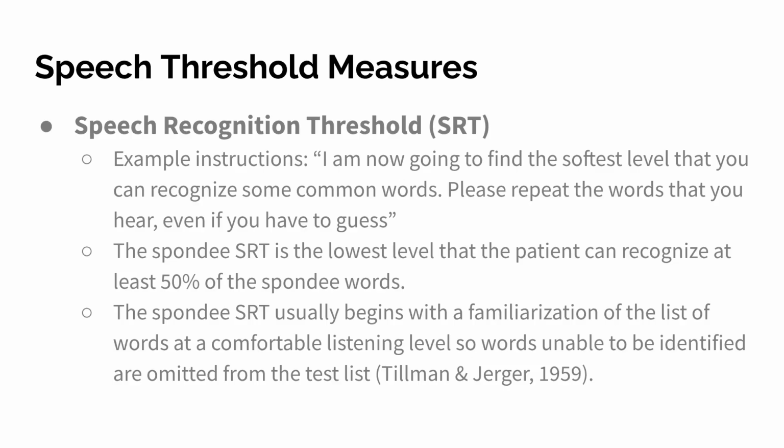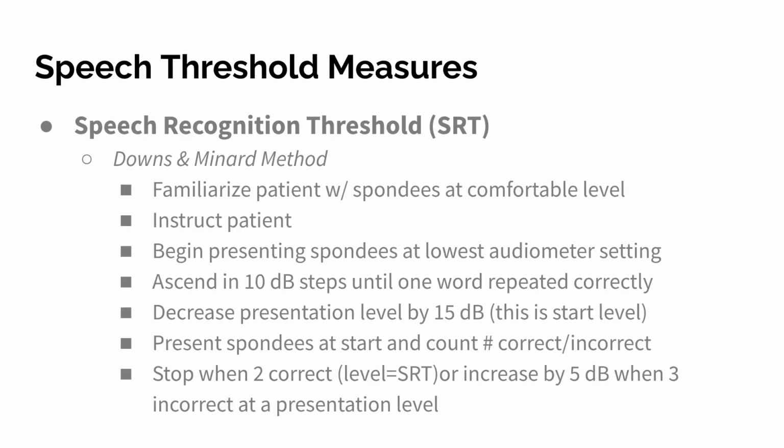These are fine too. Spondee SRT, or spondee speech recognition threshold, is the lowest level that the patient can recognize at least half of the time. Spondee SRT usually begins with a familiarization of the list of the words at a comfortable listening level, so words unable to be identified are omitted from the test list. I already mentioned that.